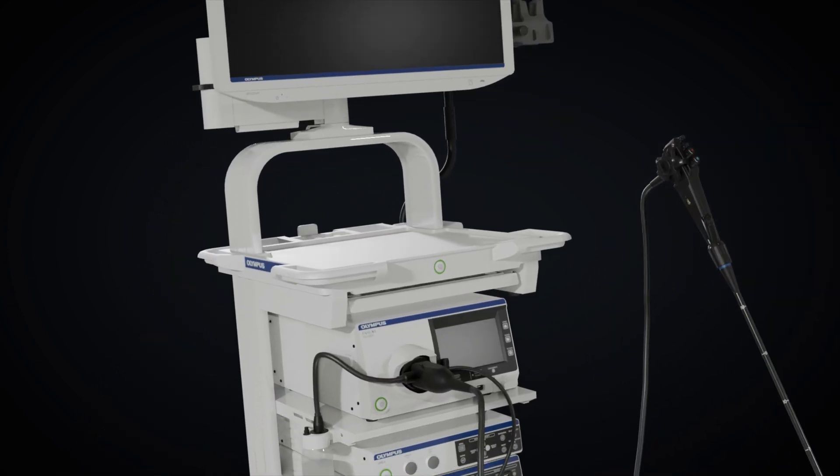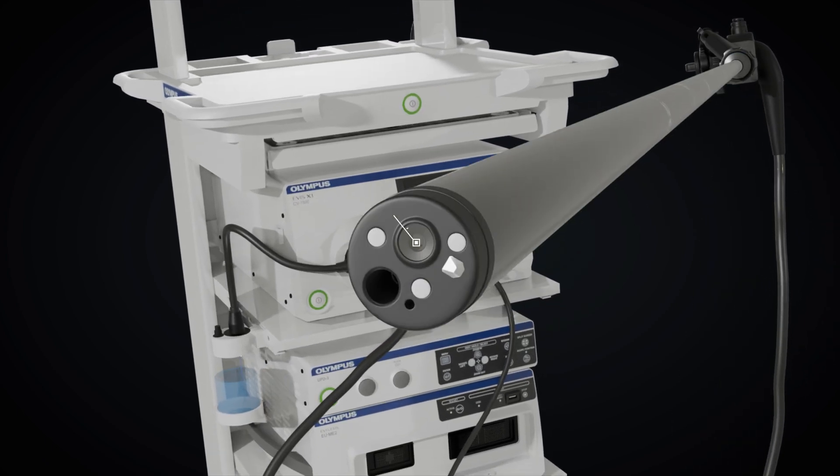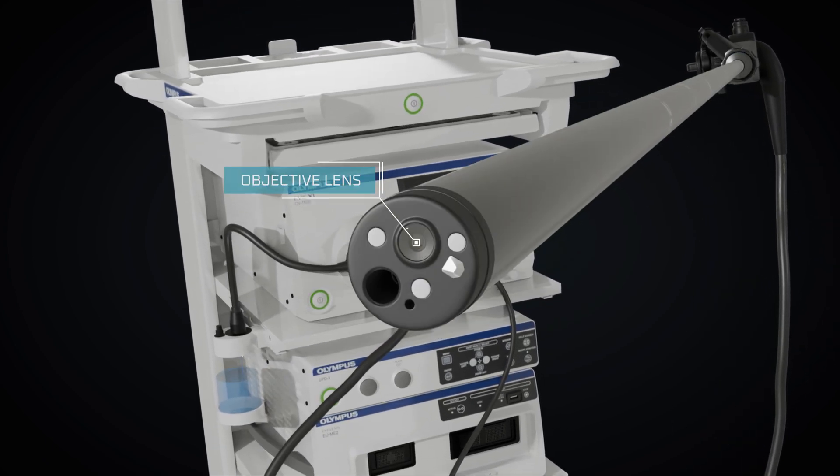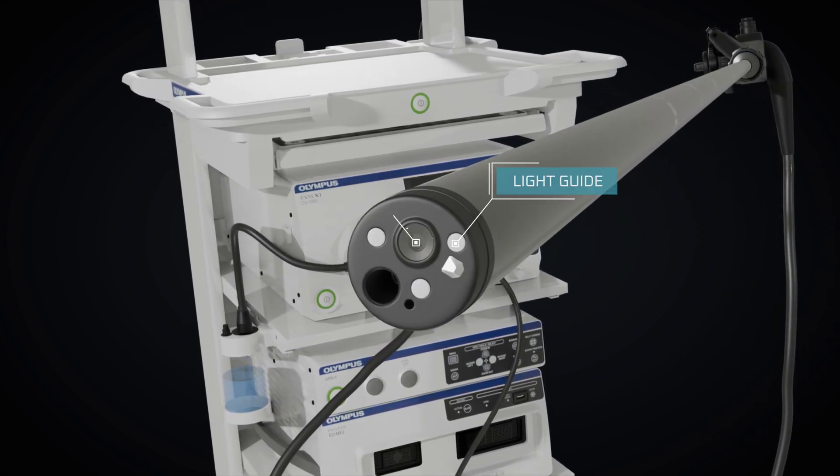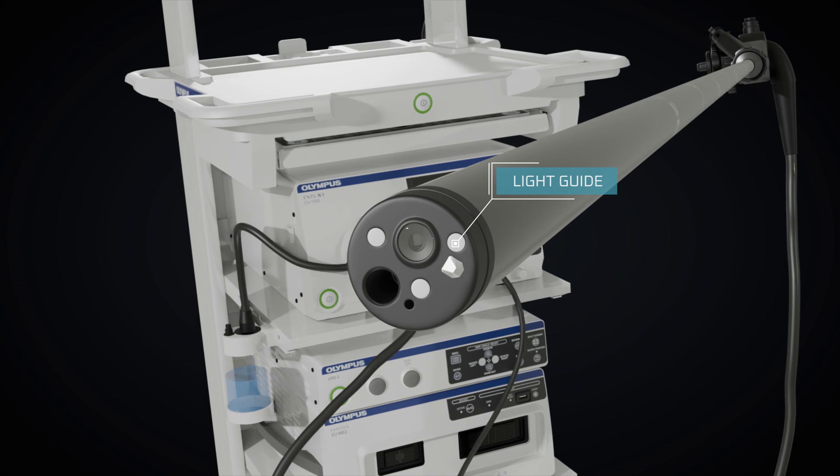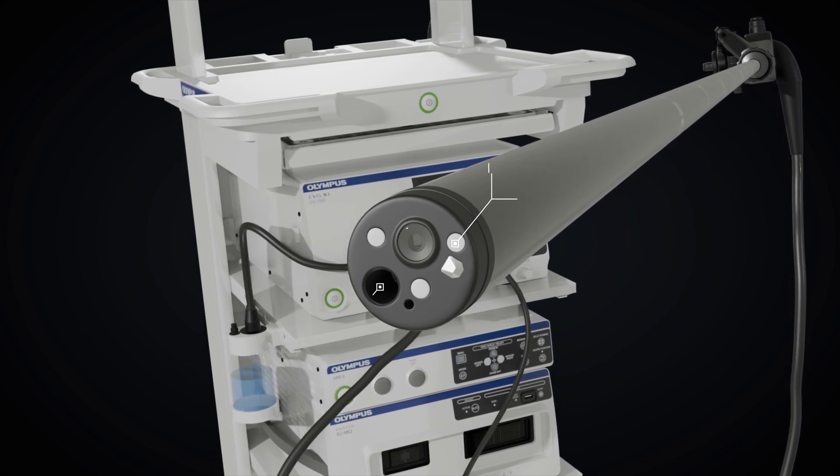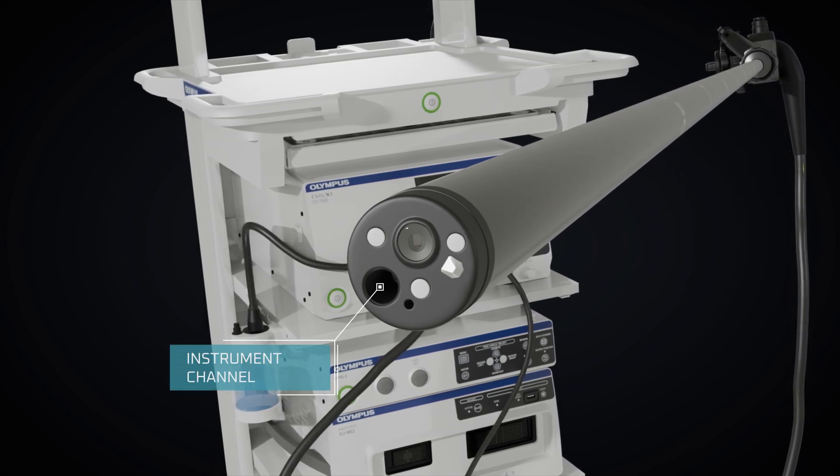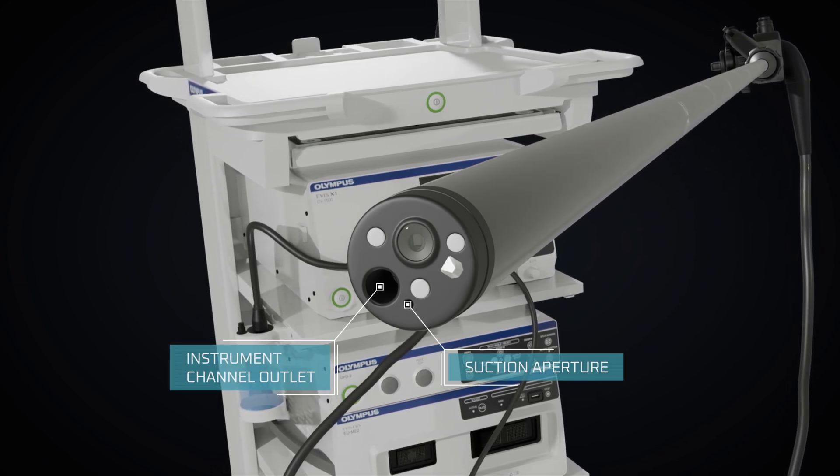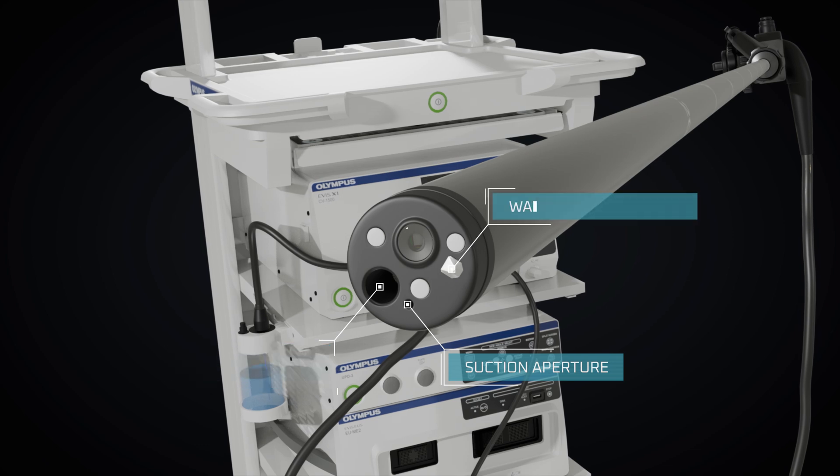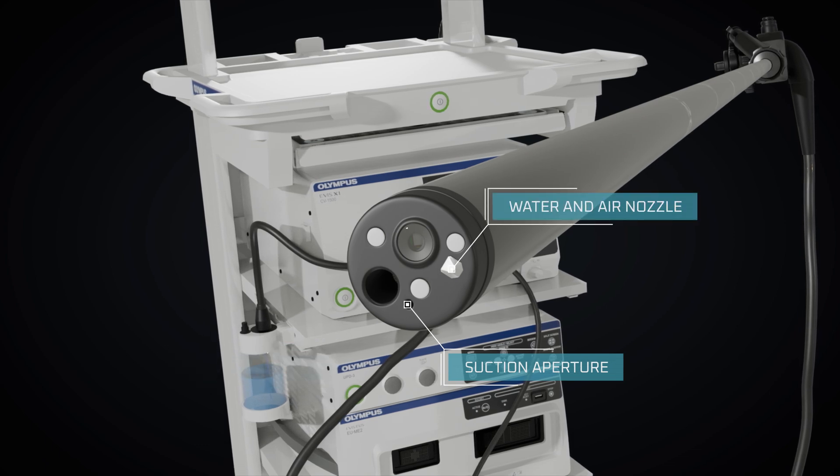On the tip of the insertion section, there are five main parts: objective lens and image sensor, light guides for transmitting light from an external source, instrument channel outlet, suction aperture, and nozzle for water and air delivery.